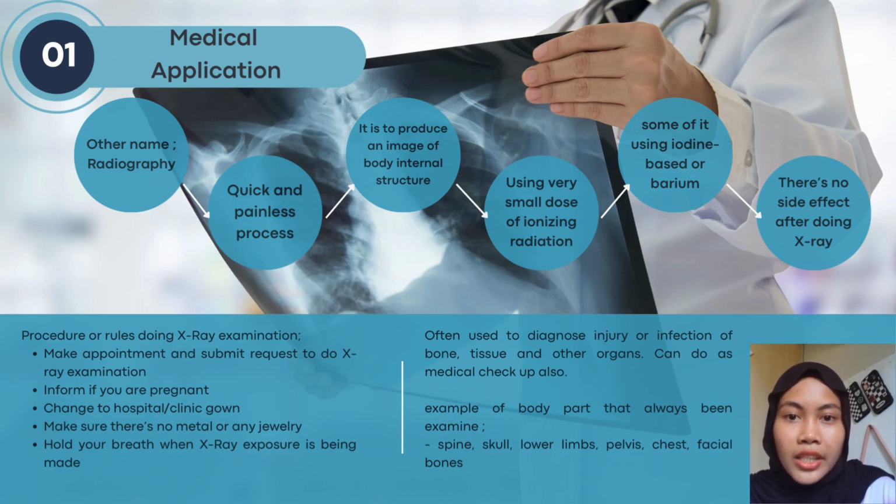To do the X-ray examination, there are rules and procedures we need to follow. First, make an appointment and submit a request to do this examination so the doctor can analyze if you really need it or not. Second, inform the doctor if you are pregnant to protect your baby. Then make sure there is no metal or any jewelry and hold your breath when the X-ray exposure is being made so that there is no movement in the image.